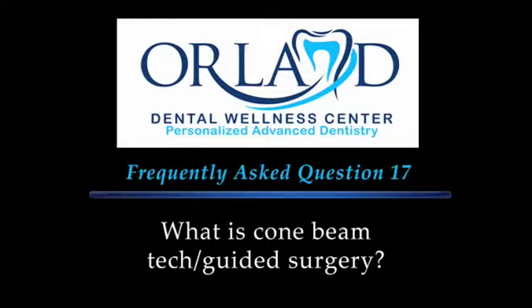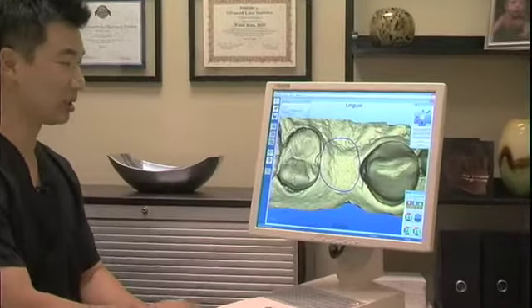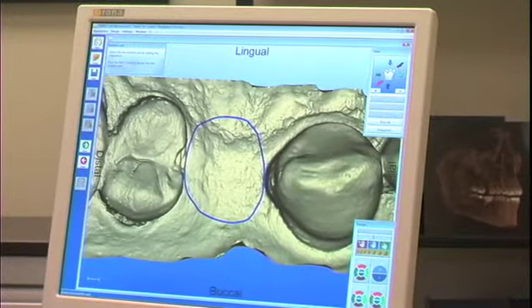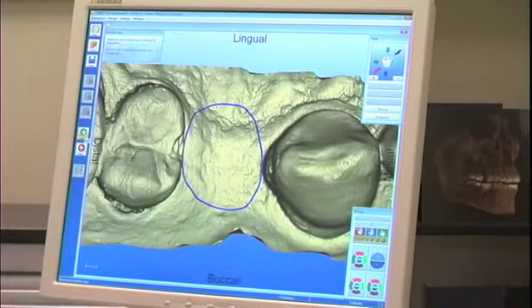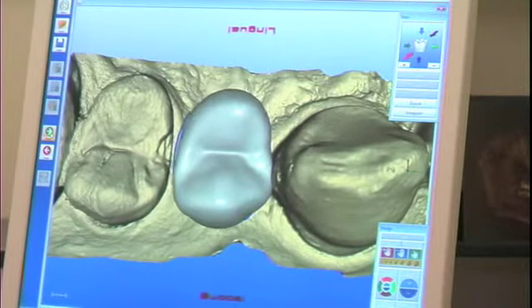Guided implant surgery is a minimally invasive surgical technique where we utilize the most advanced dental technologies to basically retrofit a crown and to more accurately place dental implants. This is accomplished first by utilizing our CAD-CAM technology. We first take a scan of our patient in the edentulous site — or where the tooth is missing. Now in this area, I've marked out where we want the crown to go, and we're virtually fabricating a crown in this site where the tooth is missing.